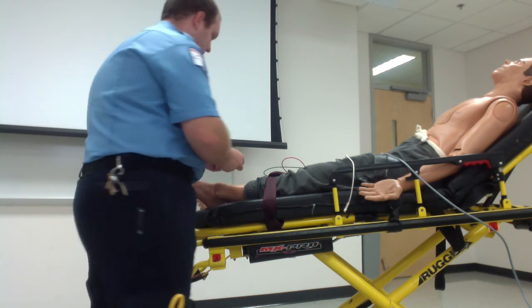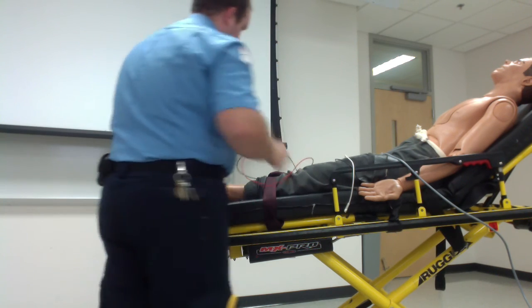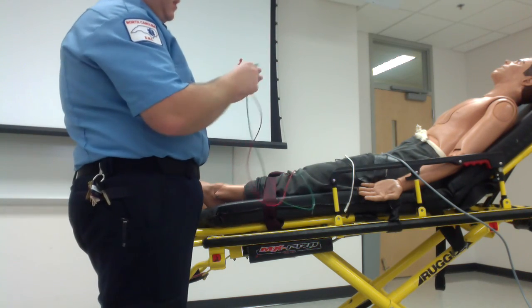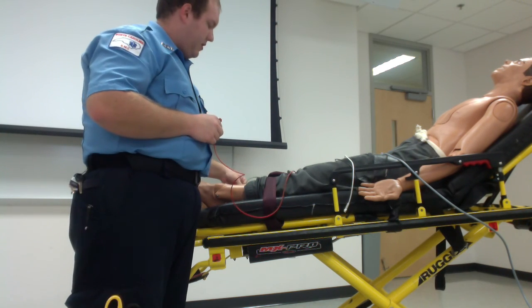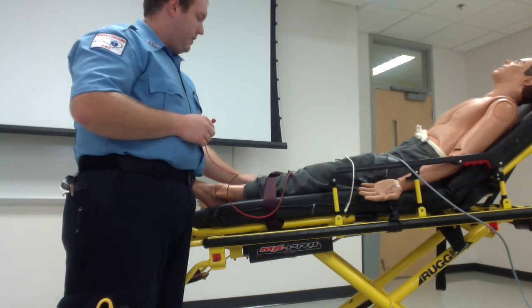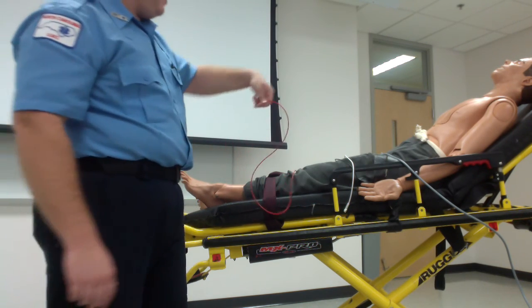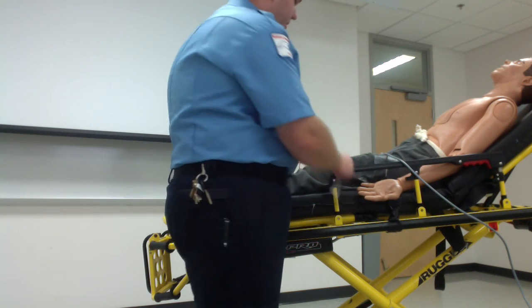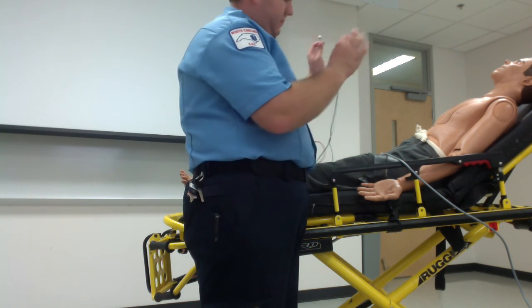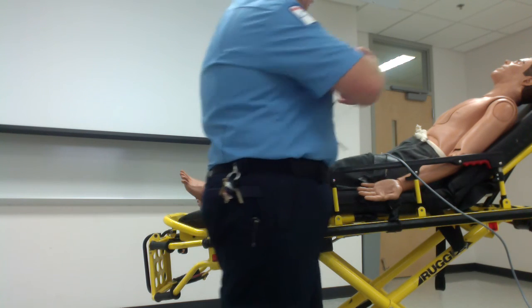So pull off your leg leads. Your right leg lead is going to be a grounding, or neutral, lead. As you put it on, you won't really get a view from it. It's just that grounding wire that goes down. Just stick them on right where you go. Pull your upper limb leads out and stick them on as well.